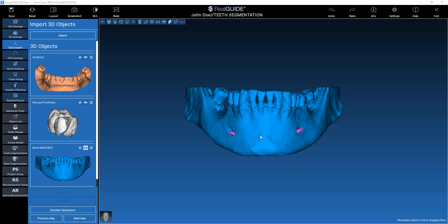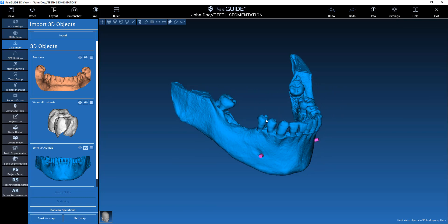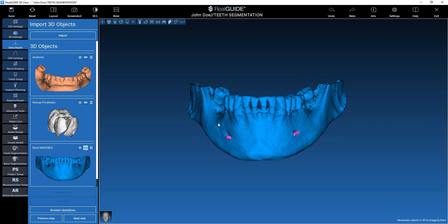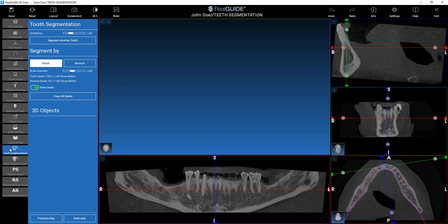After segmenting the bone, it's now possible to segment every tooth and save it as an STL file. In order to perform this operation, we click on Tooth Segmentation.